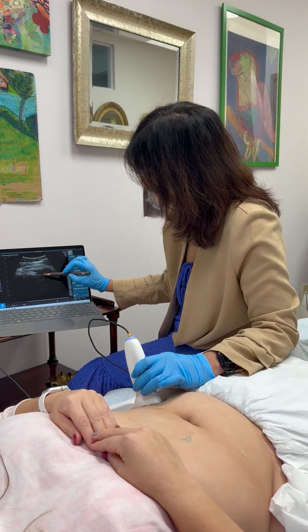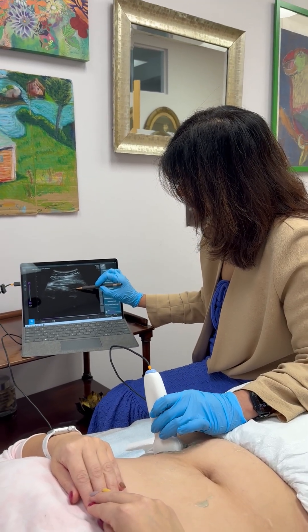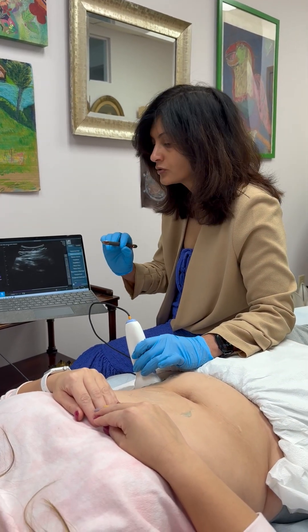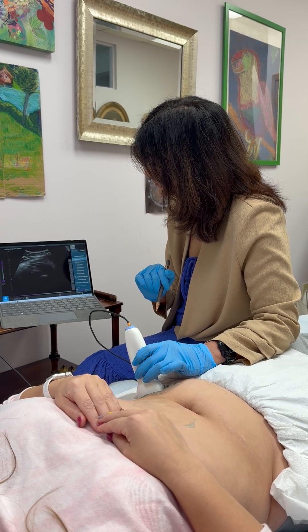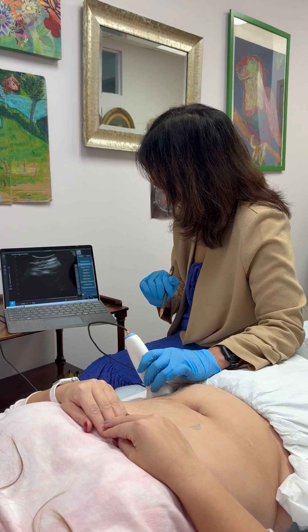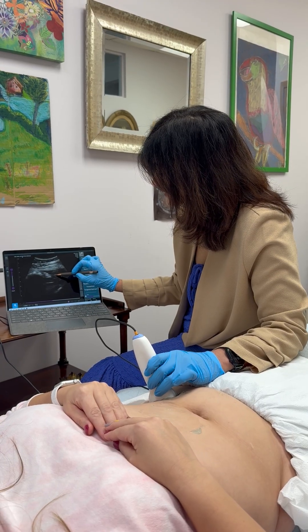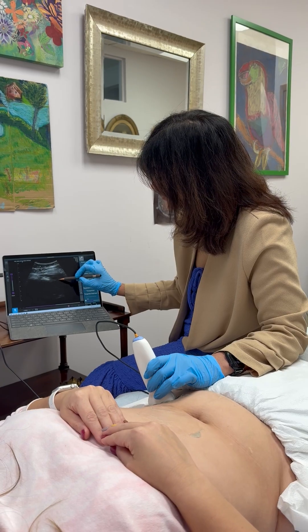So let's see if we can make it kick in. Look at these two white lines — do your core, but do it very little. Don't do ten of what you think you need to do. Good, and let go. Let's try that again — do just a little bit. That's pretty good.